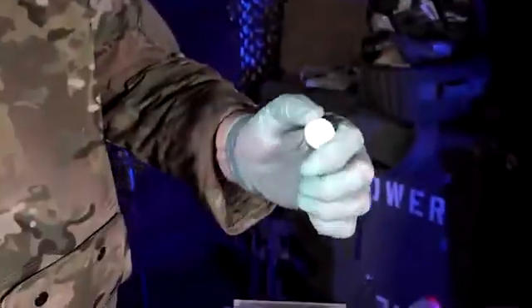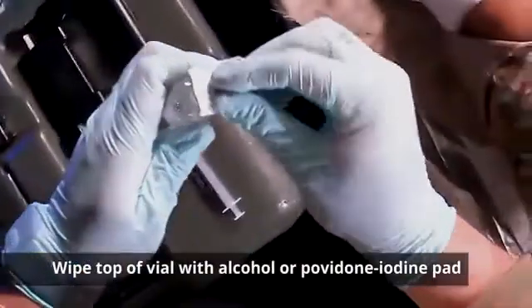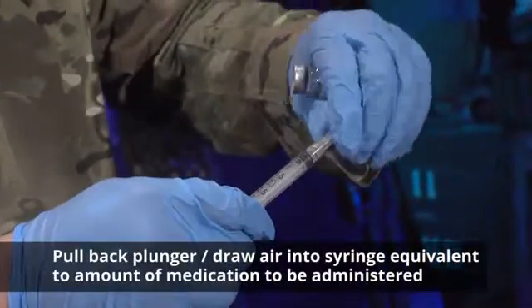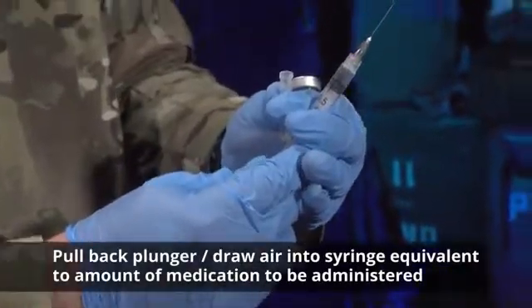Pop off the plastic cap on the top of the medication vial. Then wipe the top of the medication vial with an alcohol or povidone iodine pad. Remove the cap from the needle and pull back on the plunger to draw air into the syringe, equivalent to the recommended amount of medication to be administered.